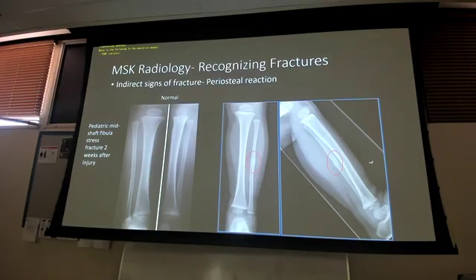Now, if they weren't having any pain there, they didn't have any injury there, and you just happen to find that, that becomes a little bit more of a conversation. Maybe it's positional, maybe it's not. But if they're coming in with pain in their lower leg for the past 2 weeks, complaining, they fell off the playground, or even mom and dad don't know what happened, they just been limping and complaining of pain, I'm gonna call it an acute occult fracture. Good question, right? It's where a lot of that patient conversation, history, presentation of illness, how does that come into play to help you distinguish over what's probably going on here?